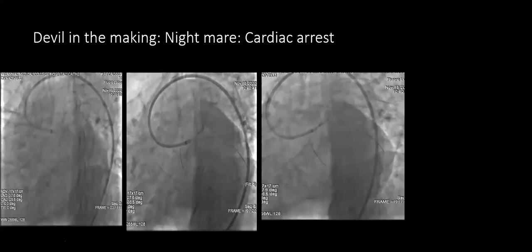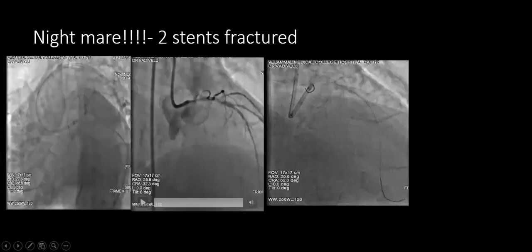This is after post dilatation. You can see it was post dilated with 4 and 4.5 mm. Even 4.5 mm was used to treat the ectasia. The ectasia segment grew after the vessel had grown like anything. Once that calcium went away, the vessel grew. This is one of the important things. After good lesion preparation, we have to reassess the vessel size in calcified lesions, because many times the calcified vessel will look undersized. If you have done good preparation and given good cocktails, the vessel size more often changes, and imaging more often helps.